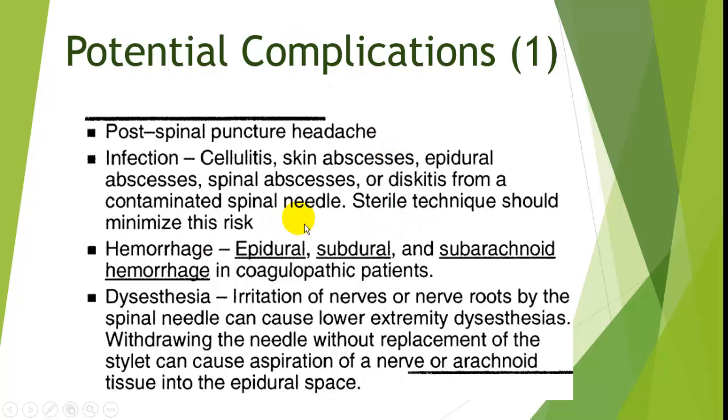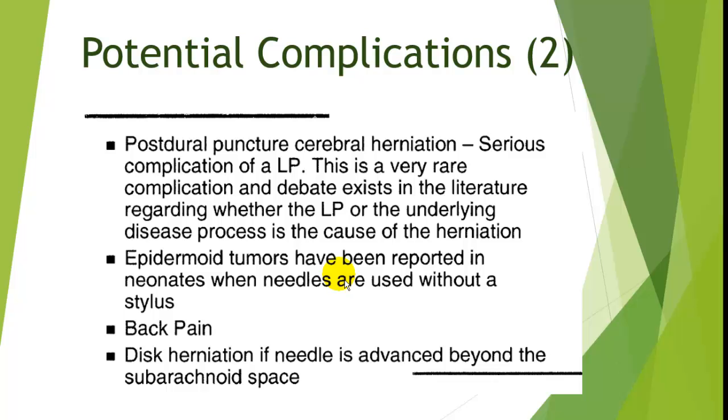Other potential complications, like any procedure, would include infections or bleeding, particularly if you didn't follow the above guidelines regarding coagulopathies. Of course, patients can get a sensory sensation going down the nerve roots, and so as you place the needle, some patients may feel some shocking or paresthesias down the lumbosacral roots.